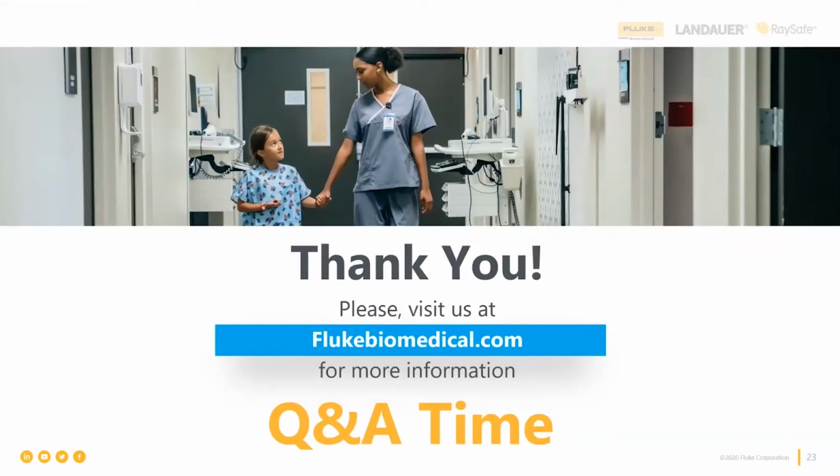Okay, so the first question that we got today was, how can we check enclosure leakage, touch current, and defibrillator? Is it possible to check AED? It's a little tougher with an AED because an AED, first of all, is battery powered, number one. So there's no power cord, no ground pin, no protective earth. Now we're talking about electrical safety now, so it's a little bit outside the scope of this webinar, but I'm going to answer it anyway.